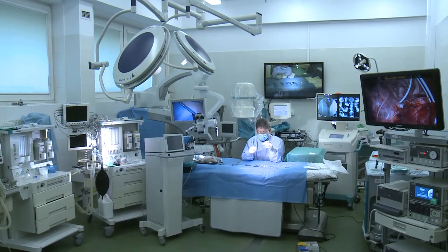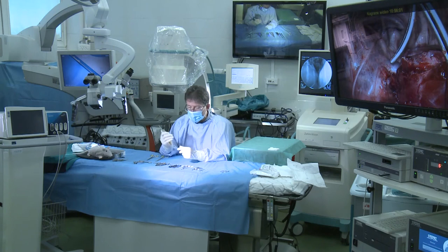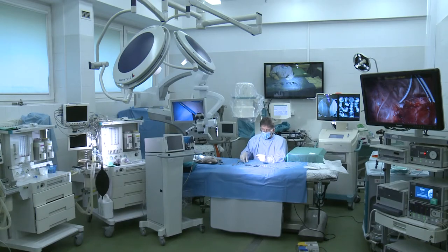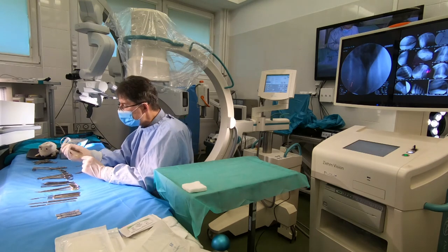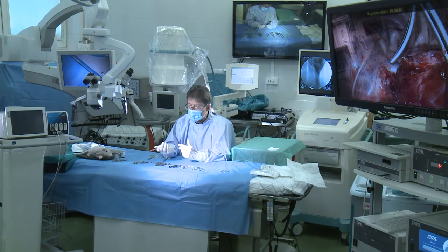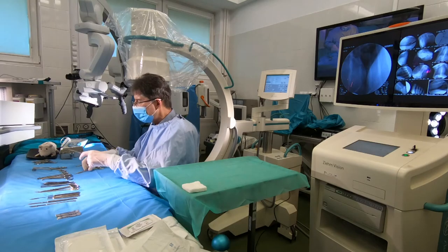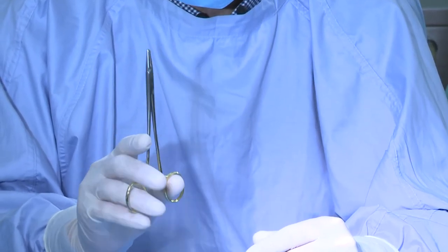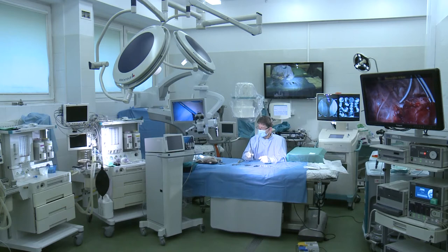We have two most frequently used needle holders. This is the Hegar needle holder. And this is the Mathieu, invented by a French surgeon. For beginners, it is very much appreciated. But in time, most surgeons change to Hegar needle holders for a very simple reason: with this lock here, you can destroy your gloves and need to change them pretty often. That's why after the first experience, the reflection is: we will change to simple Hegar. Hegar also has a lock and is a little bit more difficult to operate, but with time it becomes really very handy equipment.